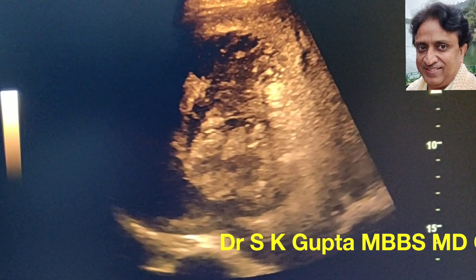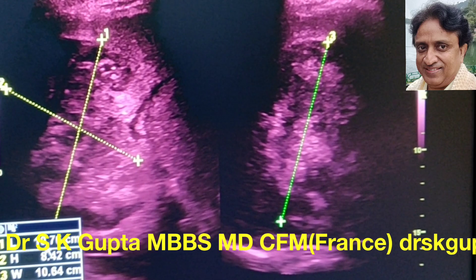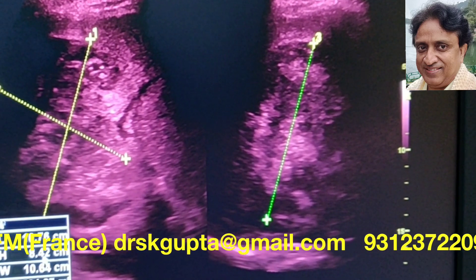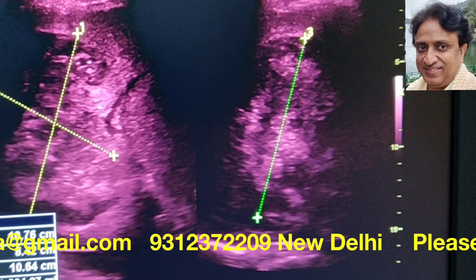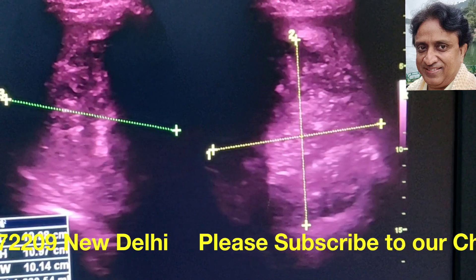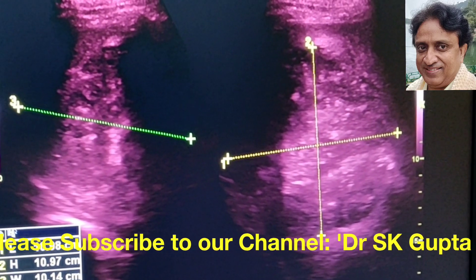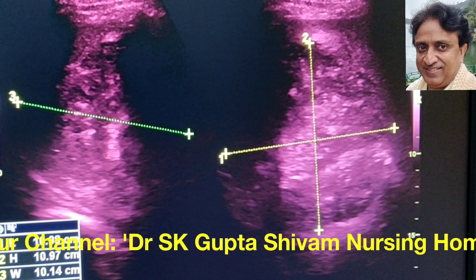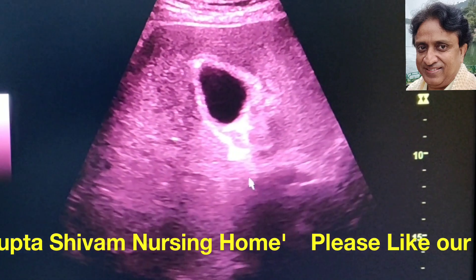When we tried to measure this abscess, we found it is about 10 cm in one plane, 10 cm in another plane, and 8 cm in the third plane, giving a volume of nearly 500 ml. Another measurement was done and it was found to be 640 ml.